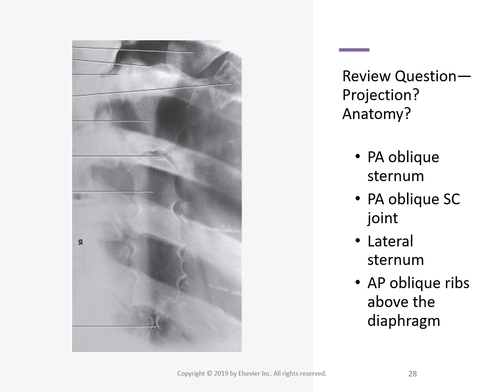And then the body of the sternum is the seventh line, and then the final line is the xiphoid process. You can identify the body because it's got the Rambo knife shape. It's got those little sawtooth articulations, kind of looks like a steak knife or a Rambo knife. And then the manubrium looks almost like a kid's sheriff's badge on the x-ray. And so that's probably the easiest way to find the sternum. They don't always look this pretty, so look for the sawtooth side of the body. Look for that Rambo knife side.